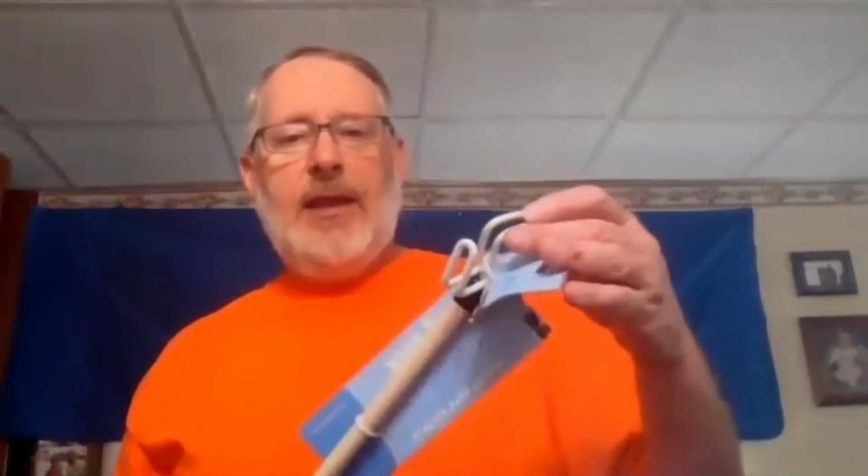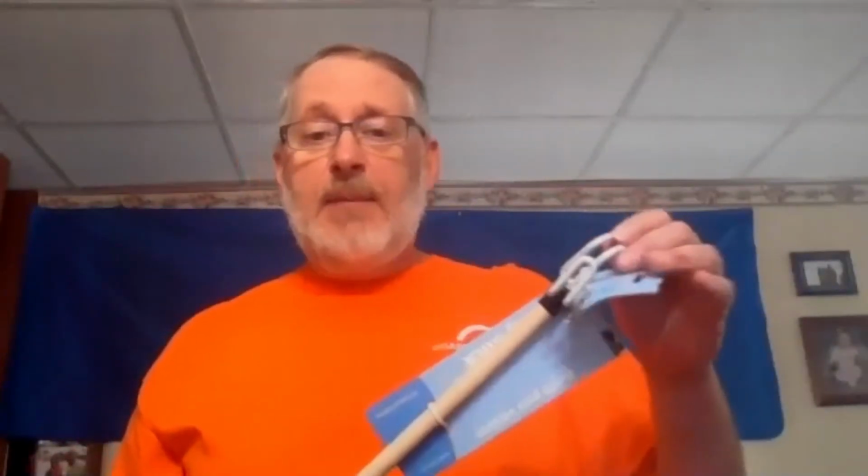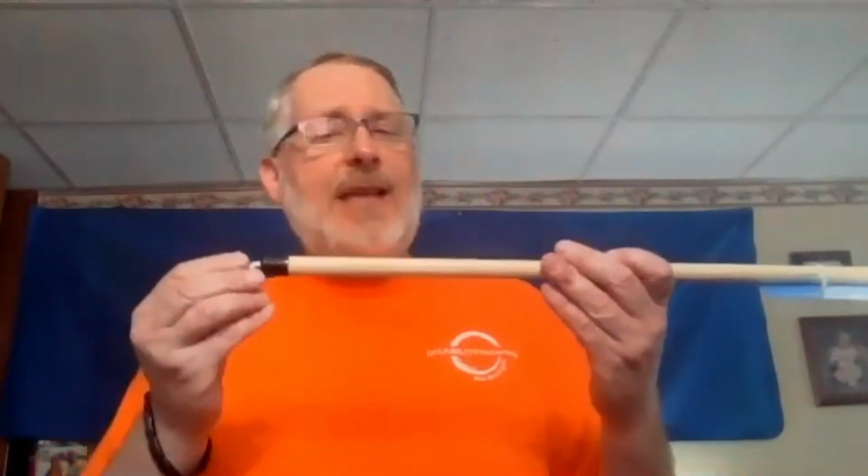The next thing I have for you is called a dressing stick. It's a piece of wood, probably 2-3 feet long. It has an S hook on the end of it right here. It's made of metal, coated in plastic. This end helps you put on shirts, coats, maybe pull up pants. Very useful for stuff like that. On the other end of it is a C hook. Same thing, made of metal, coated with rubber.